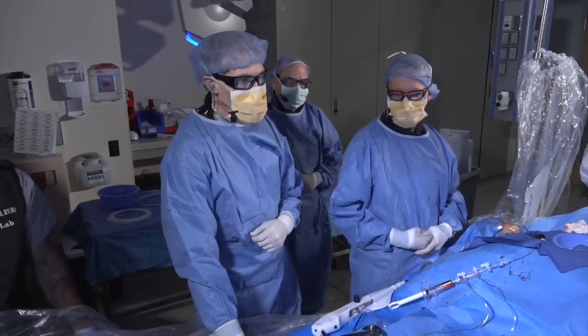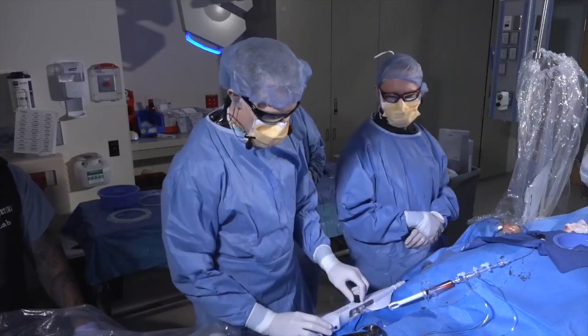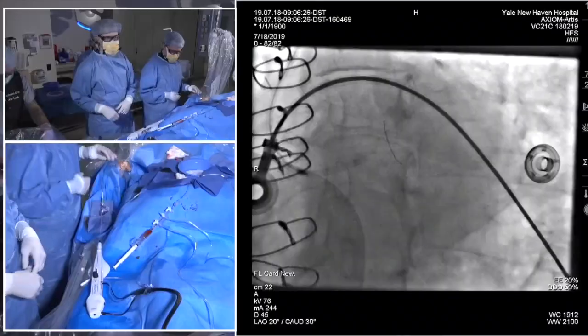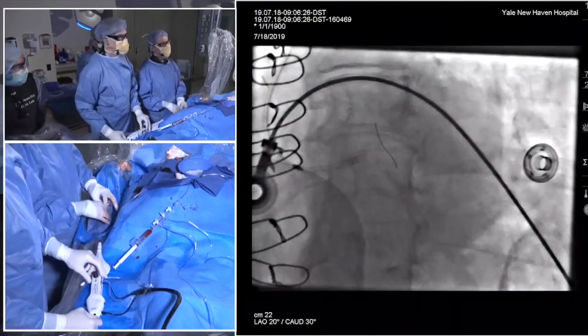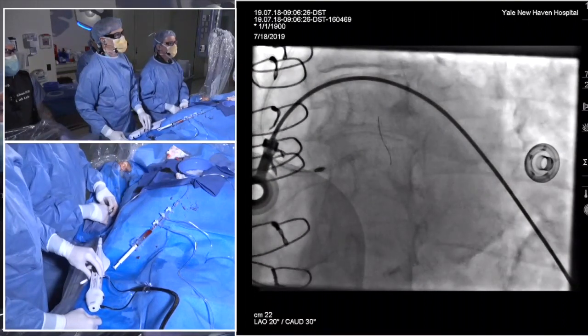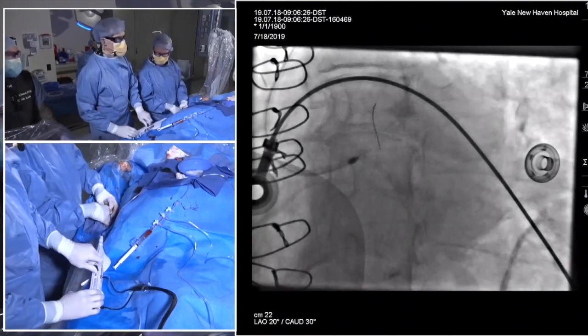So why don't we let you work? I think we started talking a little bit about this issue of support. Frankly, in our lab, with the right revascularized, normal EF and an EDP that started off low, we wouldn't even put in a sheath in the iliac. We've actually had more issues with a 4-French sheath getting kinked and bleeding around it and that sort of thing, and we're pretty facile at ultrasound-guided access that we would just proceed without support.